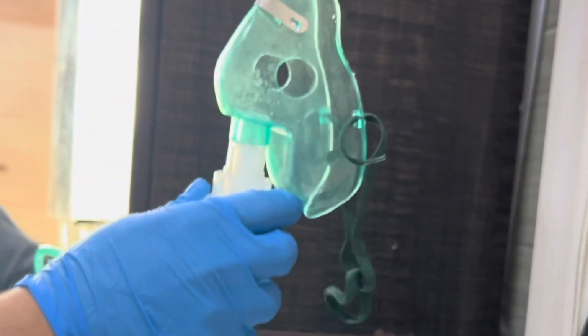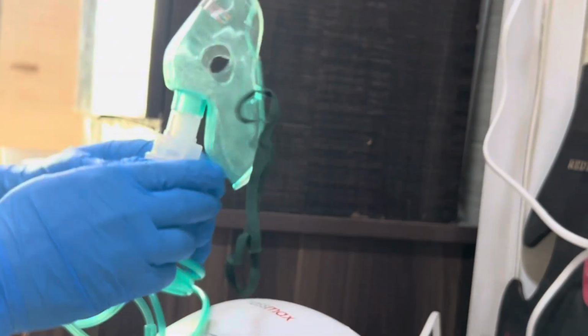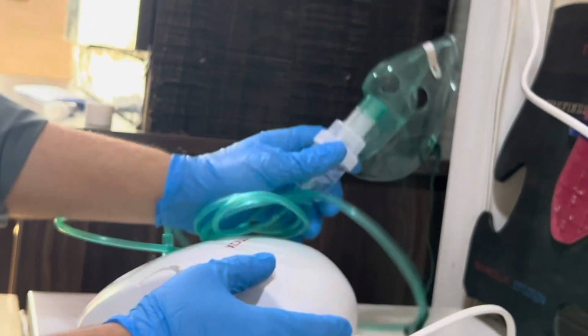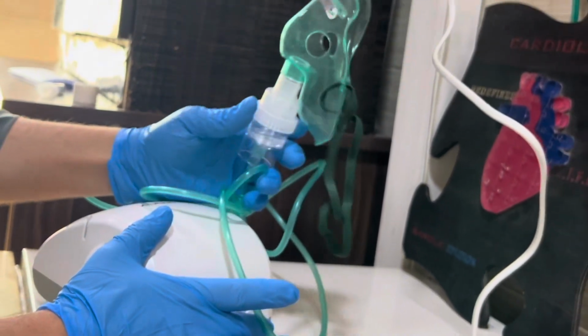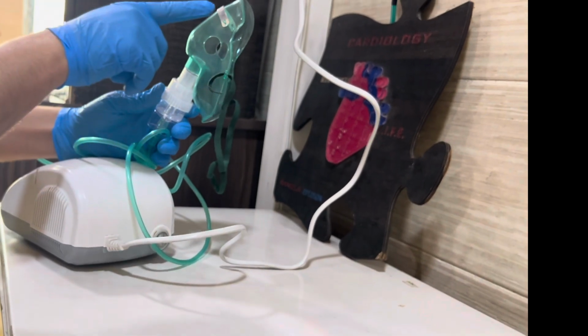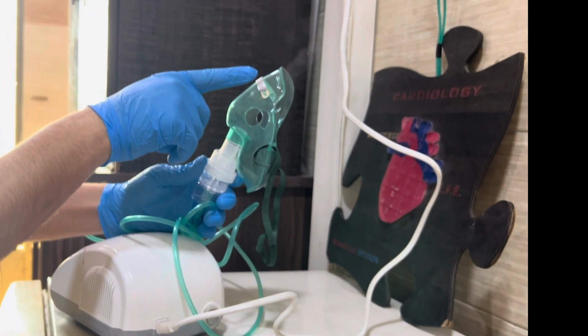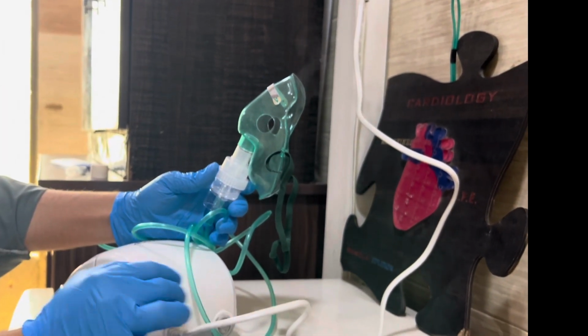Then how to attach it to the patient and how it works. Switch on the electric power and then turn on the nebulizer machine. You should turn on the nebulizer machine. Let's see, he turns on the nebulizer machine and the steam will start. You can see easily in the video the steam will start.